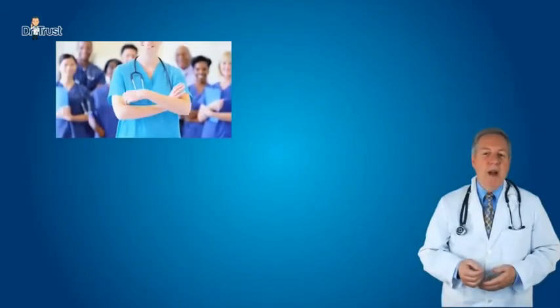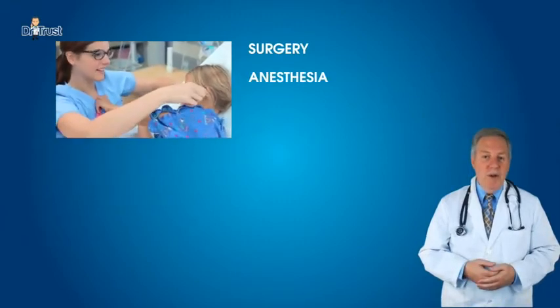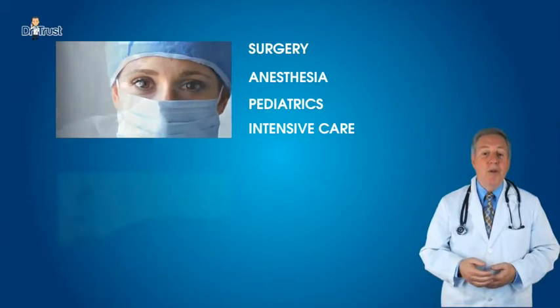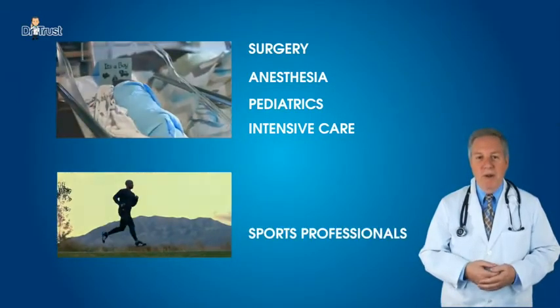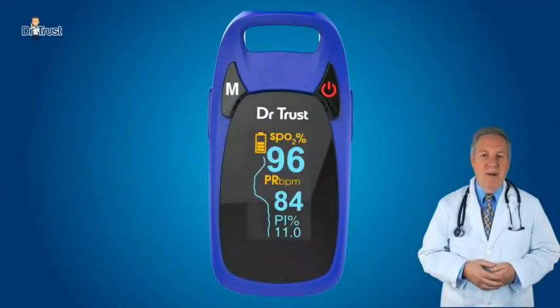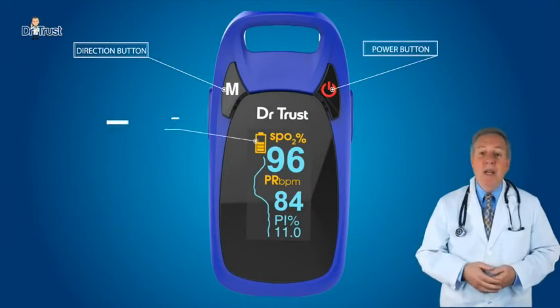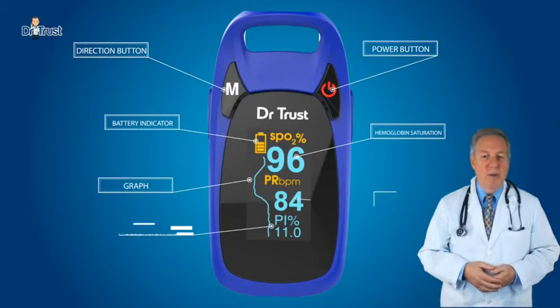The product can be used in hospitals including clinical use in surgery, anesthesia, pediatrics, and intensive care. It is also suitable for home monitoring as well as for sports professionals. The product is accurate and clinically validated. The oximeter can be used to measure human hemoglobin saturation, perfusion index, and heart rate through the finger.